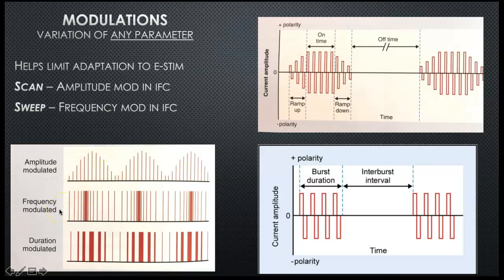Frequency modulation is these things start out, they're all the same amplitude, right? So they're all going to feel the same strength because they're all even at the top there, but they're coming in at different times, right? So there's a dit, dit, dit, dit, dit. I know, again, my sound effects are helpful, but that's the frequency modulation, right? You're changing how often they feel those pulses.